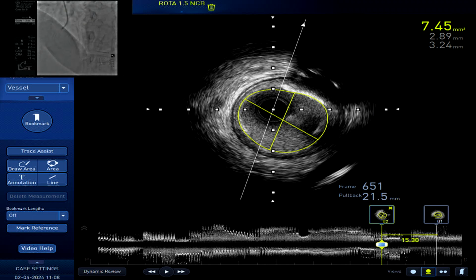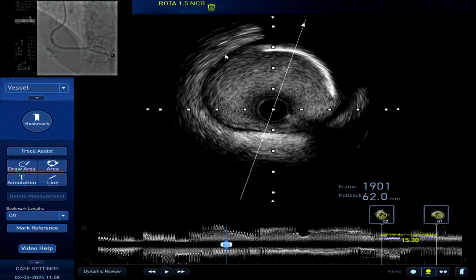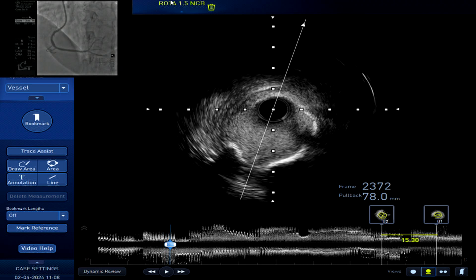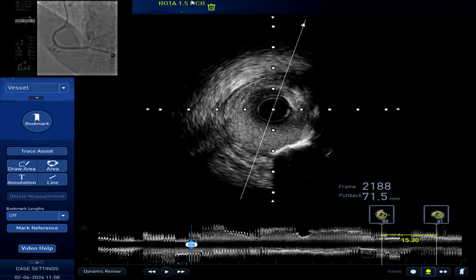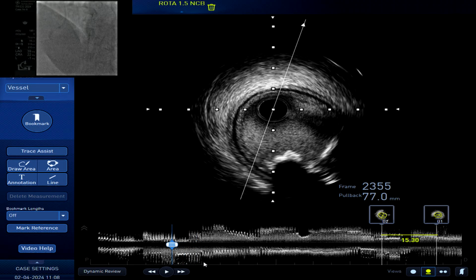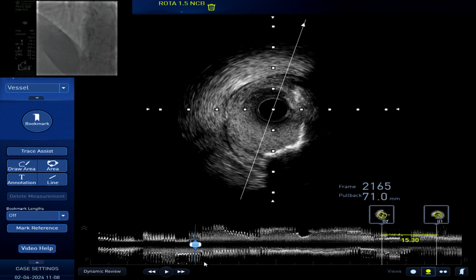Tejas sir, on an IVUS we can see the beautiful cracks in the calcium. It has been seen that when we are evaluating the proximal part, there are multiple cracks and differential cracks. Yes. And the protruding nodules also get a lot of debulking because of the rotablation. Yes. But that is where sometimes I need to learn how you exactly evaluate post-rotablator or post-IVL interpretation. I am not very good at it.